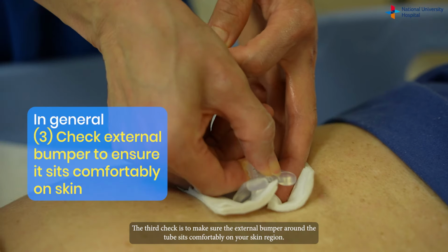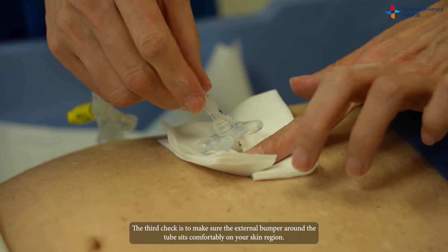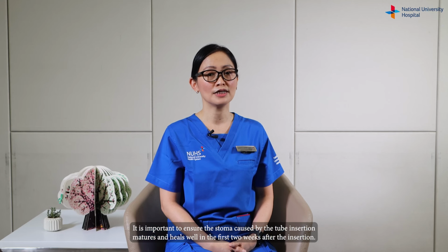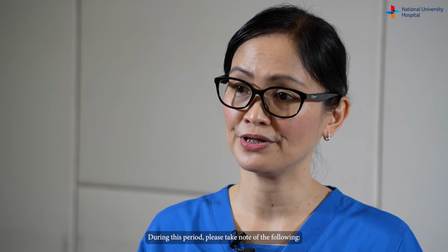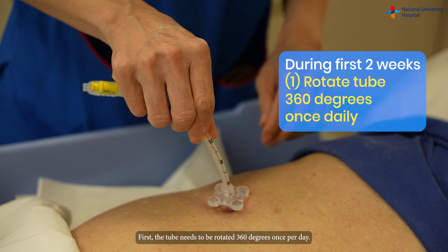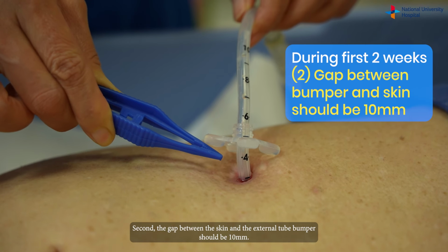The third check is to make sure the external bumper around the tube sits comfortably on your skin. It is important to ensure the stoma caused by the tube insertion matures and heals well in the first 2 weeks after the insertion. During this period, please take note of the following. First, the tube needs to be rotated 360 degrees once per day. Second, the gap between the skin and external tube bumper should be 10 mm.